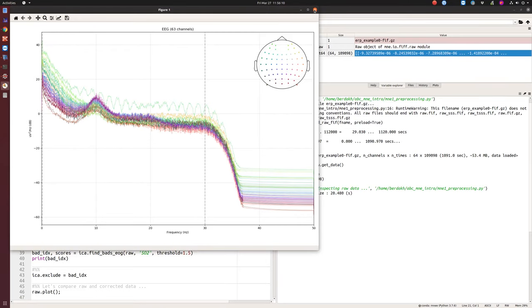Once you have the ERP dataset segmented, you may want to apply machine learning to check whether there is some discriminable pattern between target and non-target events. CLF.fit() passes input data and corresponding labels. Once we train our logistic regression, we can test it on unseen examples. cross_val_score() with cv=5 means 5-fold cross validation, cv=10 means 10-fold. Here we see the cross-validation score for each fold. That's it for today — take care, see you around.